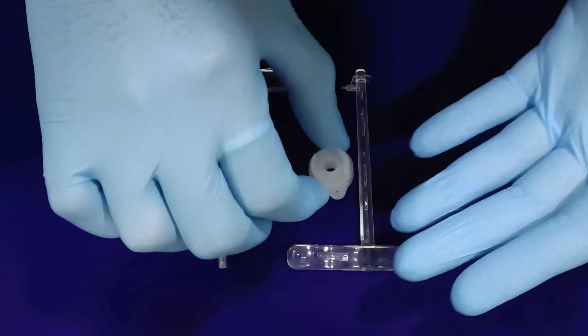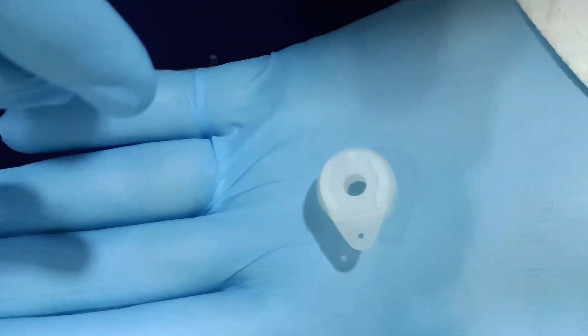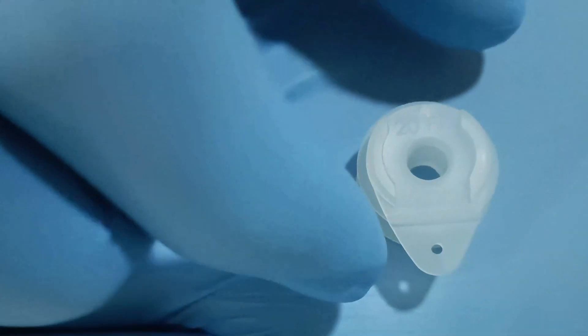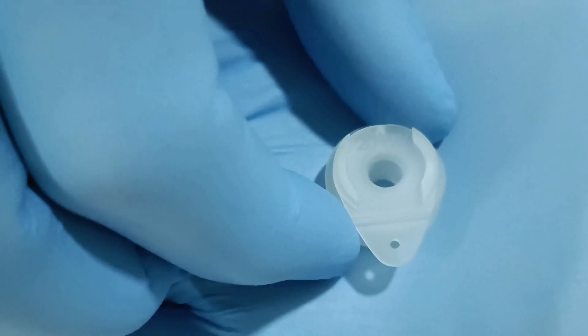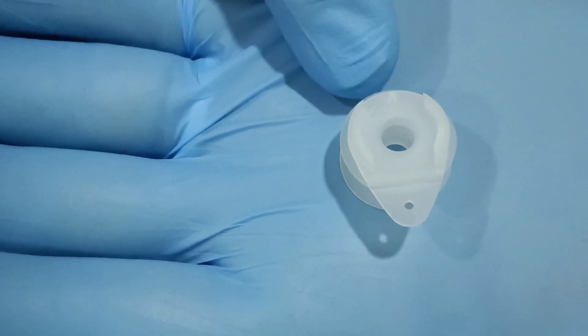Welcome back viewers. After looking at the video on world's most advanced voice prosthesis from Yon Wild Red, which has been specially designed to overcome the limitations of currently available voice prostheses in the global market, let's have a look at its assembling.